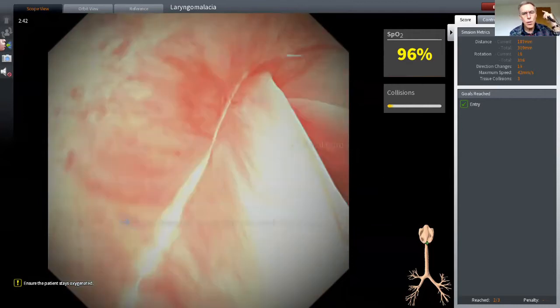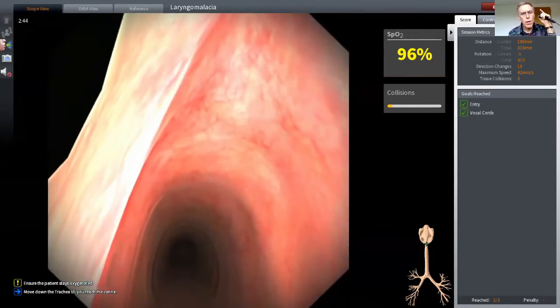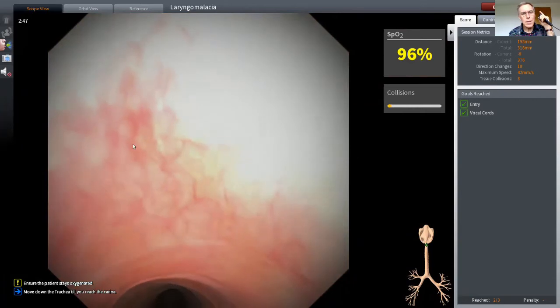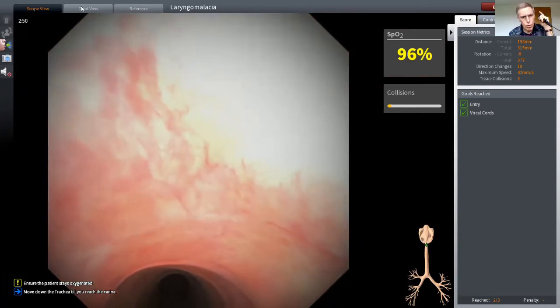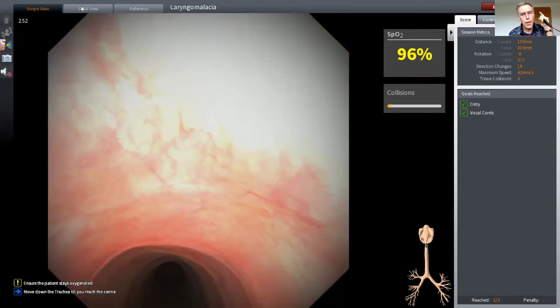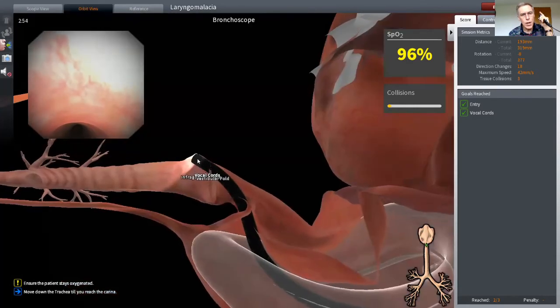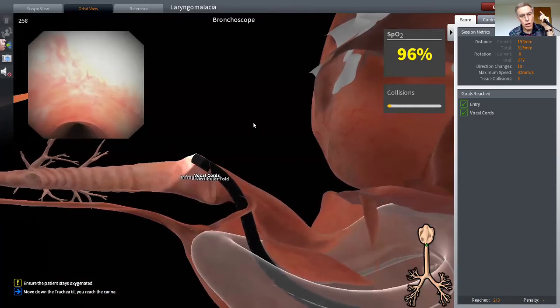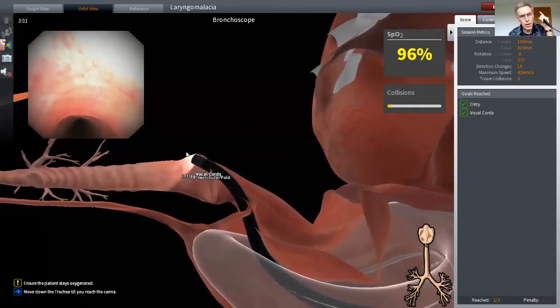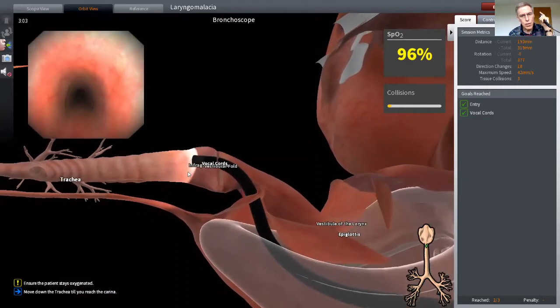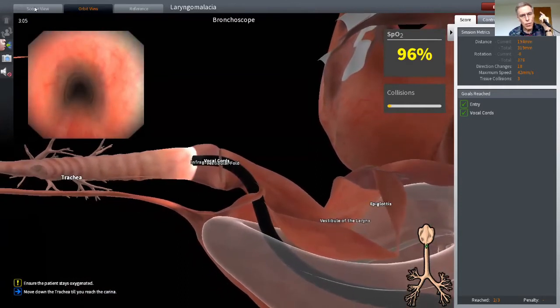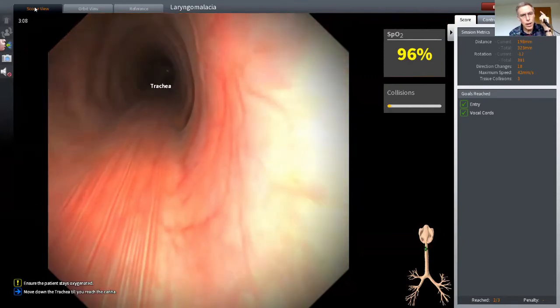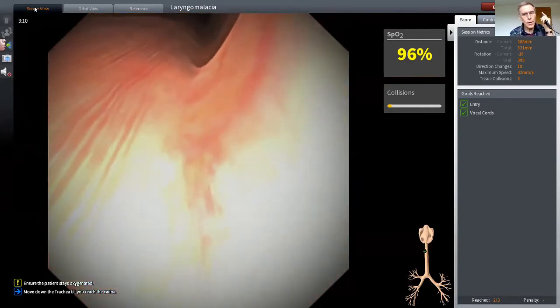Anteriorly there is the internal view of the cricoid ring, and it's quite a prominent cartilage. It's quite easy for the bronchoscope or the following tracheal tube to get hung up on that part of the anatomy. So it's important to straighten out your tip, which I've done now, in order to travel on down, unimpaired, down the trachea.